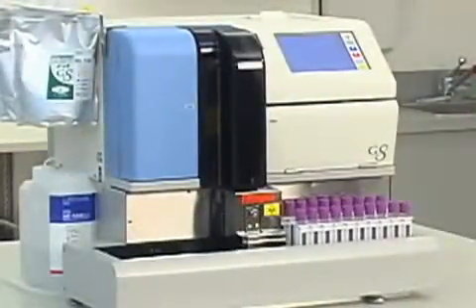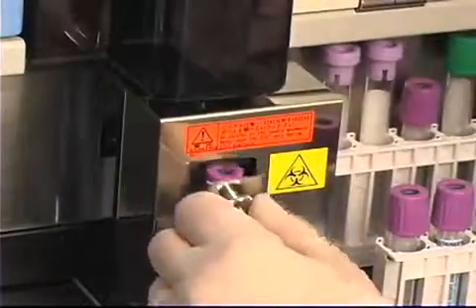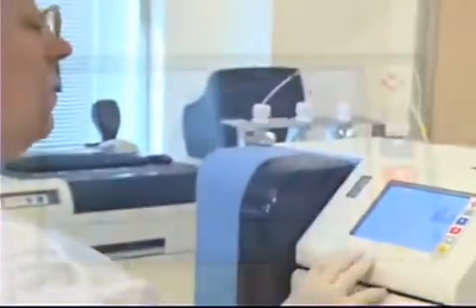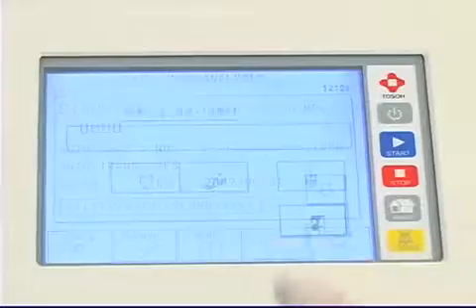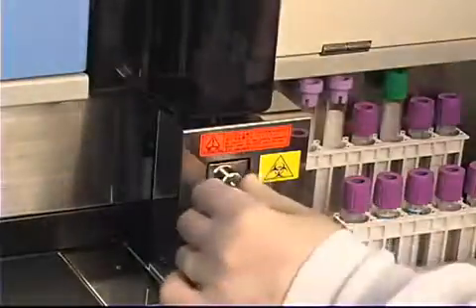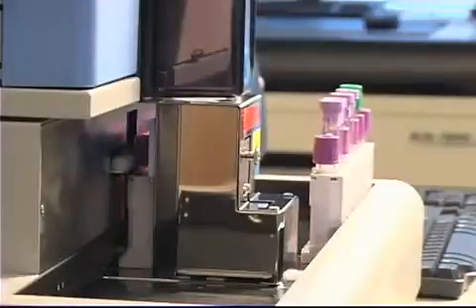Continuous sample processing lets the operator load additional samples at any time without interrupting the run. Stat interrupt capability is readily available. To load a stat specimen, press stat on the touch screen, select tube or cup, and place the sample in the stat sampling position. The specimen is prioritized for sampling, then the remaining samples are assayed.